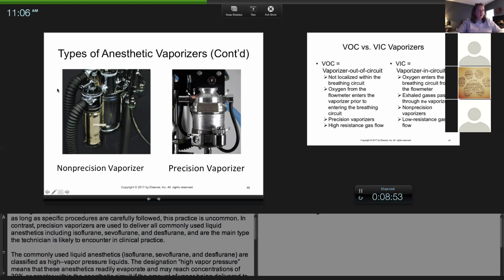And this is the circuit. But you can see attached to the inhalation valve is this jar, and if you can see this like cream colored, that's a wick. It's like a cloth wick. And so you would take this jar off, fill it with your anesthetic, and there is a valve up here. I don't know if you can see, there's like a little round thing with a pin, and you would turn just like an oil lamp.